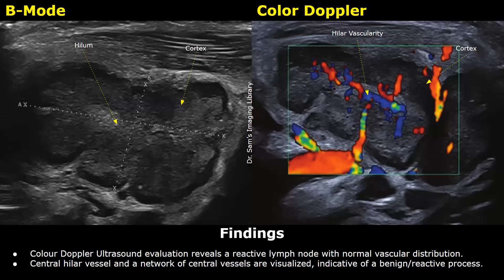Color Doppler ultrasound evaluation reveals a reactive lymph node with normal vascular distribution. A central hilar vessel and a network of central vessels are visualized, indicative of a benign or reactive process.